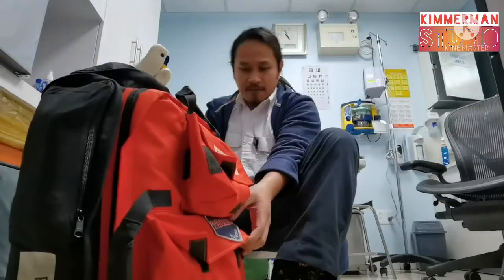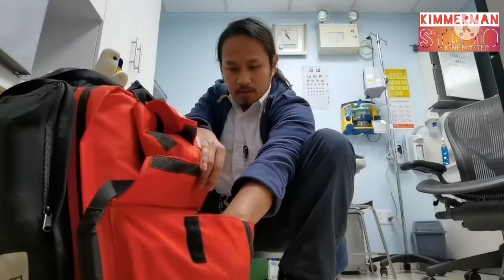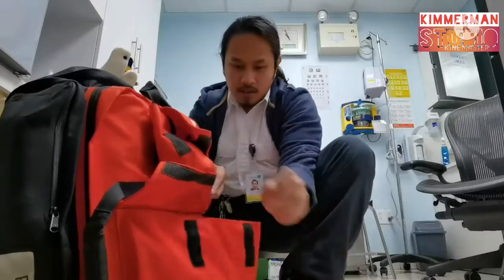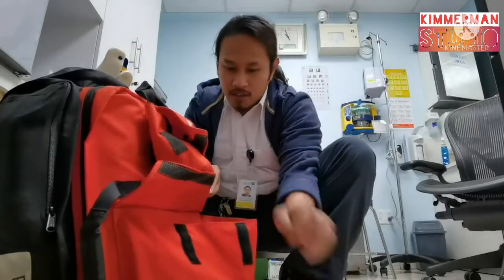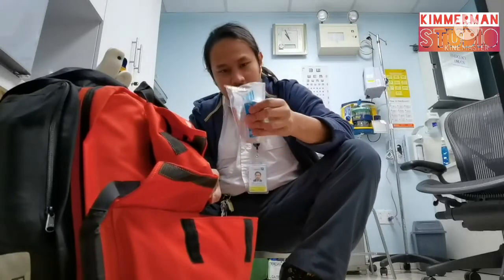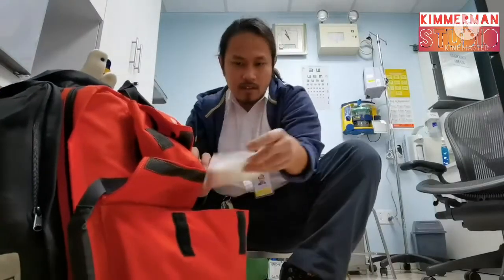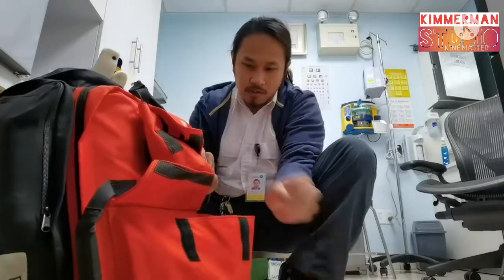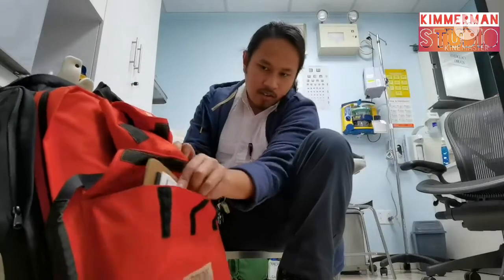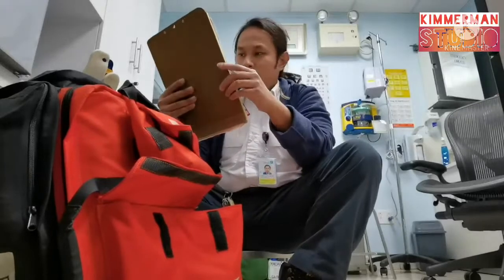Last is pocket five. Pocket five contains goggles, gloves, sheets or the rescue blanket, plastic aprons, pens, and sets of forms and triage tags. It's complete.